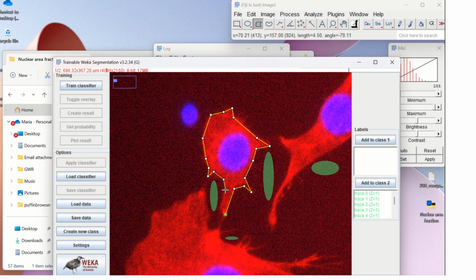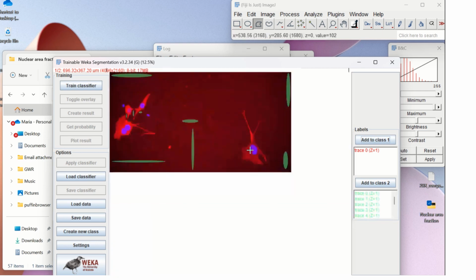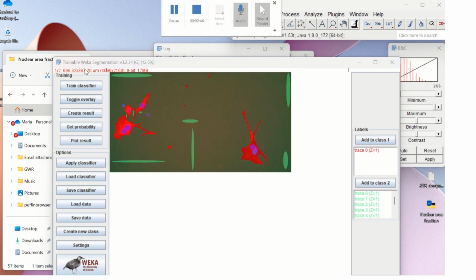to actually segment the rest of your samples for you. So that was one of them, and I think that's enough. Let's go ahead and click Train Classifier, and this will take a little while. Okay, once the button's up here like this, then we're ready to go again.